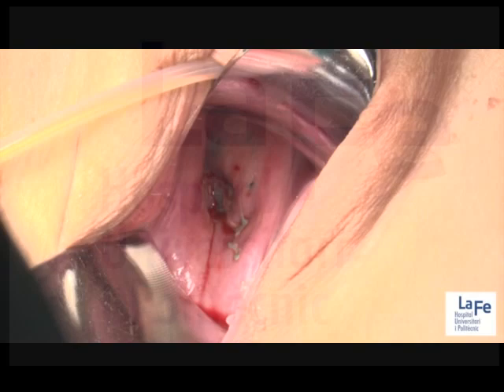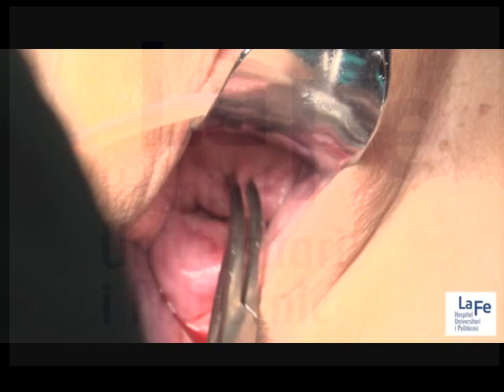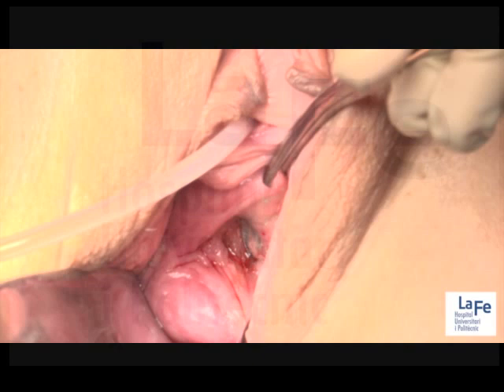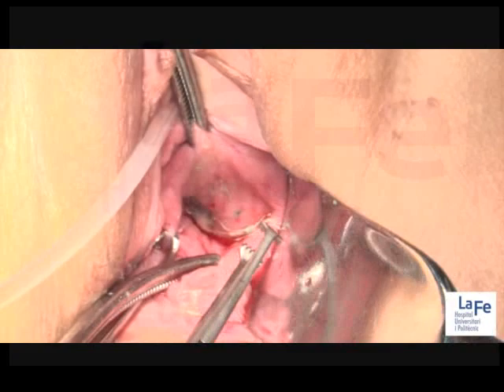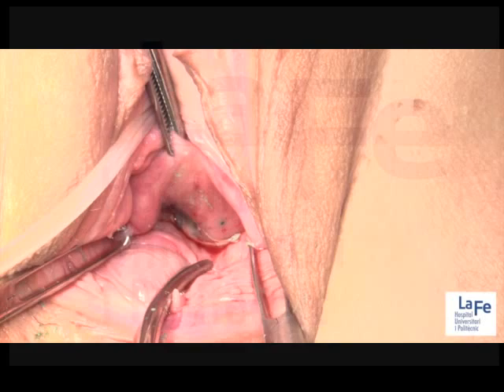Firstly, the theoretical vaginal margin was estimated at approximately 2 to 3 centimeters from the tumor, depending on its size. A circumferential incision at the vaginal mucosa was performed, followed by a vaginal wall dissection. She was proposed for sentinel lymph node detection and frozen section. As the intraoperative exam was negative, at this point vaginal closure was scheduled.